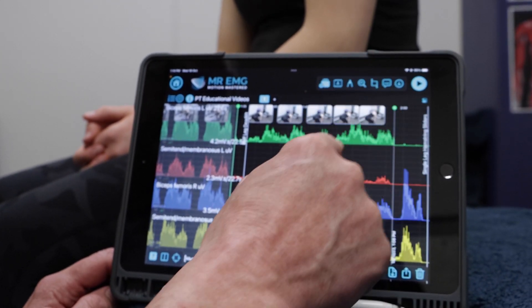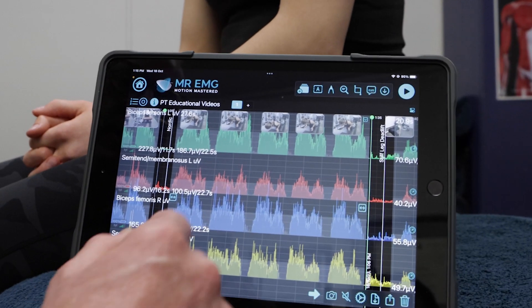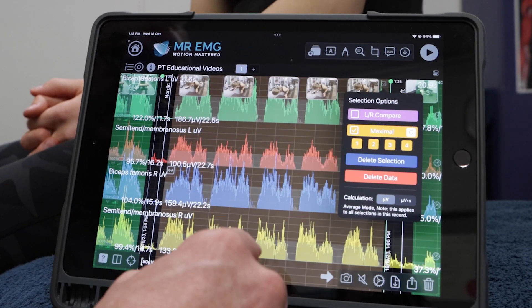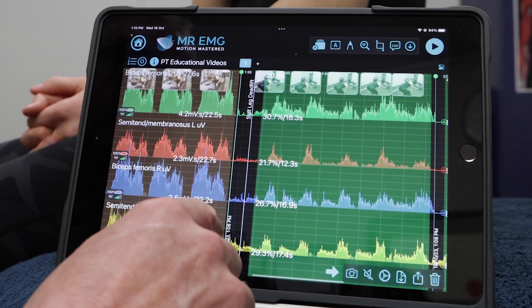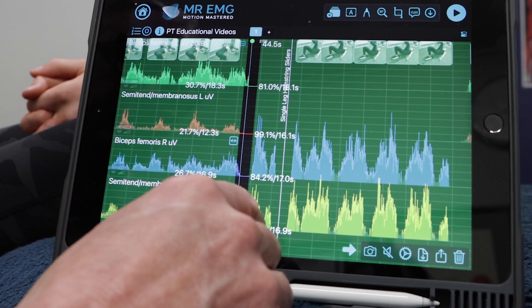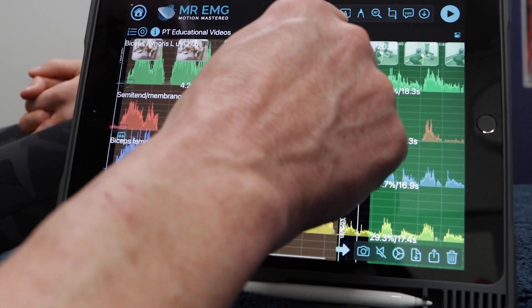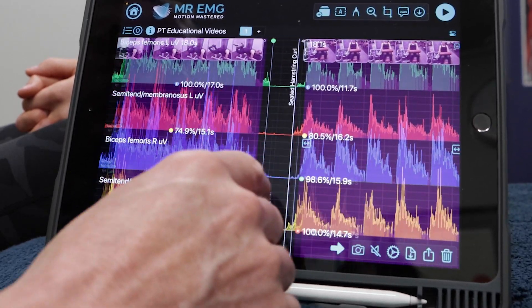When you find which exercise created the most amount of visible muscle activity volume, make that exercise the maximal and select data volume. Now you can review your client's data and gain insight into how the various exercises target their hamstrings — discovering which exercises work best for them. Assess for imbalances between legs or consider how coaching and technique changes may influence their muscle functioning.